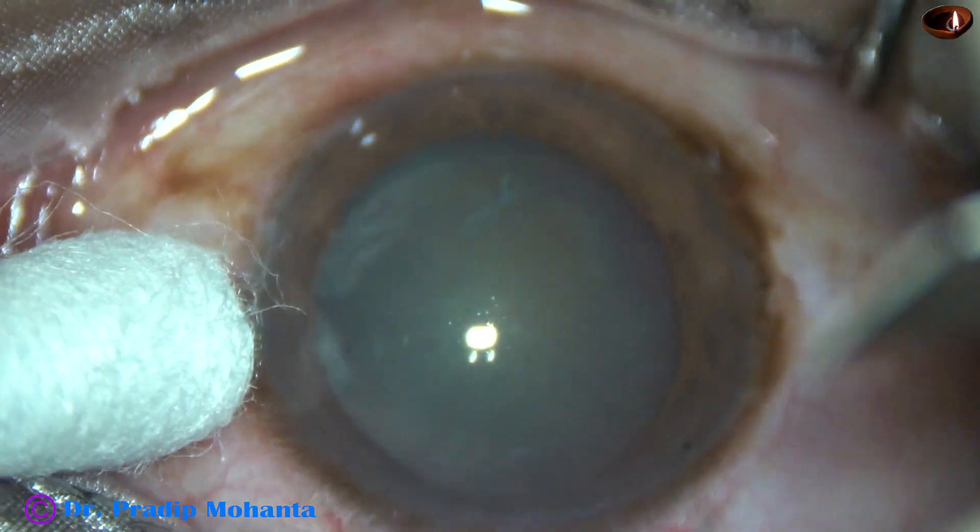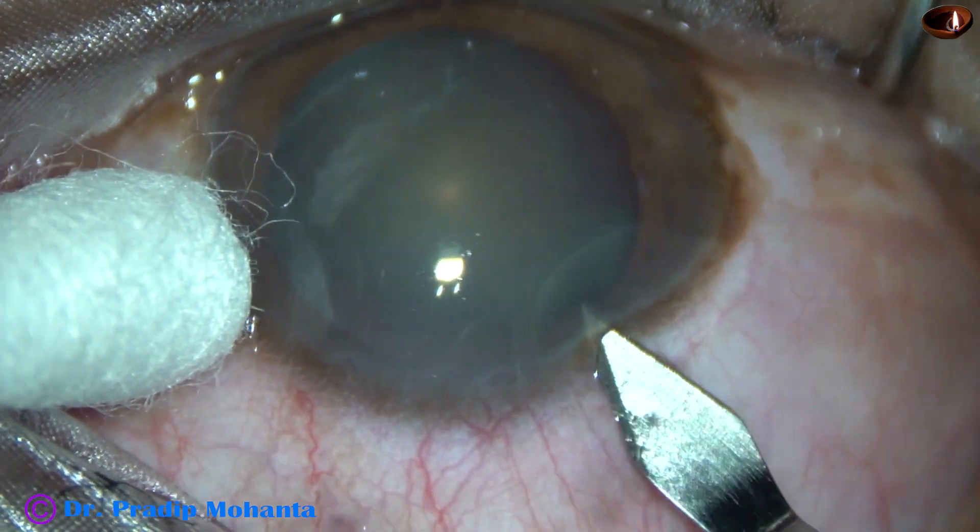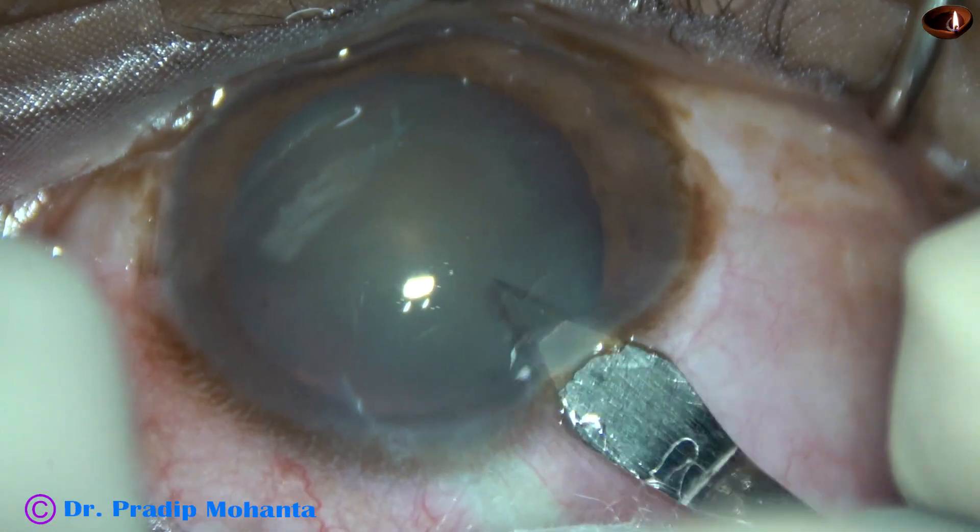This is the main incision with a 2.8 mm steel keratome on the posterior aspect of the limbus.